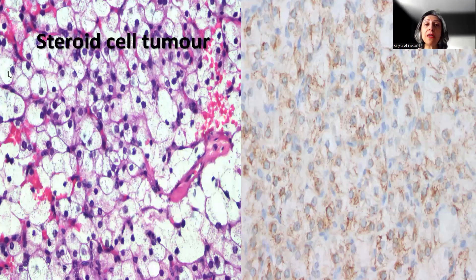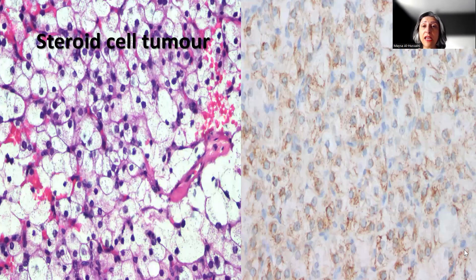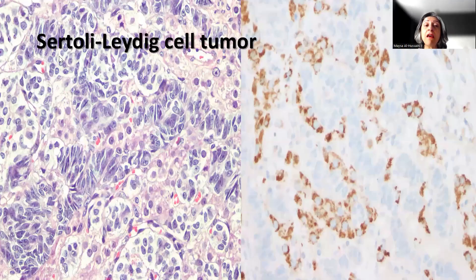Steroid cell tumor is another entity described within the ovary. It shows these large cells with vacuolated cytoplasm, and again it tends to show cytoplasmic granular positivity without nuclear positivity in the tumor cells.